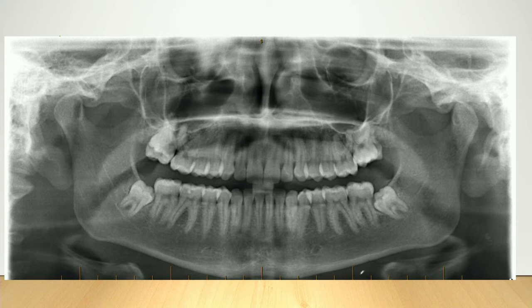So good question, Paul. This referral was for 4 wisdom teeth to be removed. When the patient came to theatre, I looked at the case, and the 7s are actually buccal to the 8s.